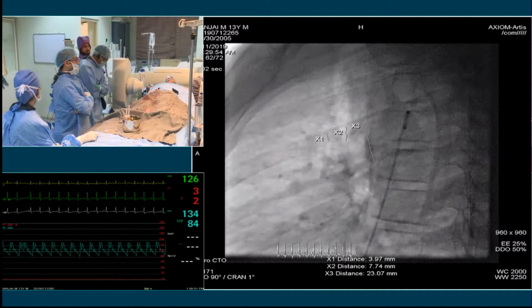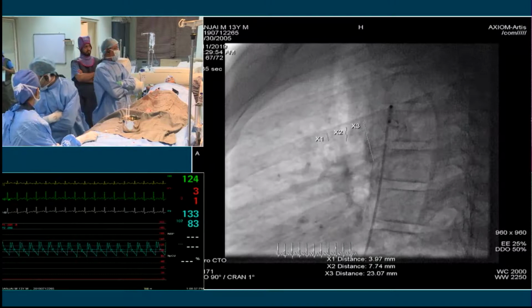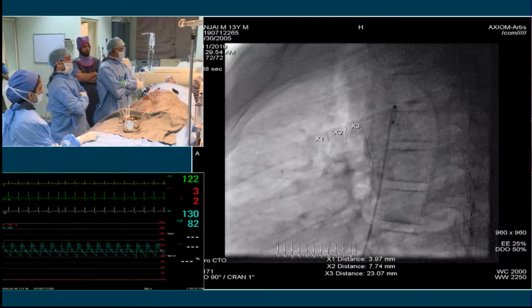For choosing the device, choosing the size, five French, I agree, ready. Agree. Echo, yeah, five French sheath ready. But I think if you do an angiogram, the whole purpose of the angiogram has to be served. Yeah. You have to see the anatomy of the duct, otherwise you don't need to do an angiogram at all.